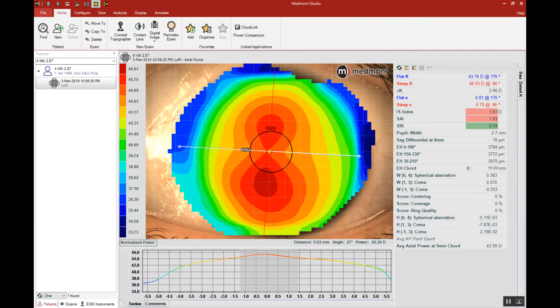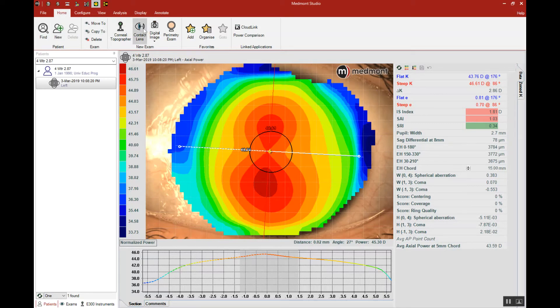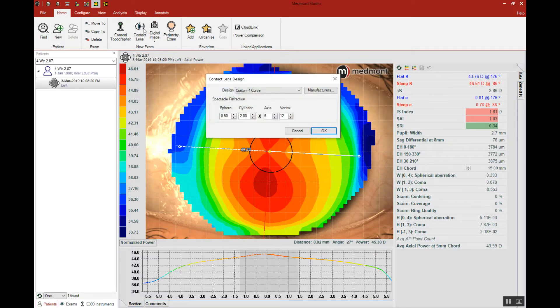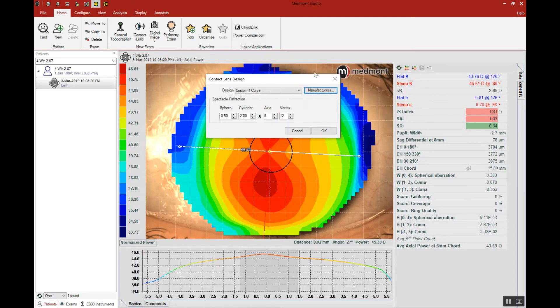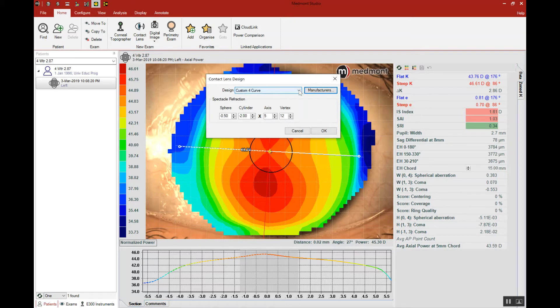Now we're ready to use the contact lens module. The next step is to go up to home and select the contact lens software. That brings up the wizard where you can enter all of the manufacturers that you use or that are available to you in your region of the world. With that selected, then all of the manufacturer's designs that you've selected will show up under the design window.